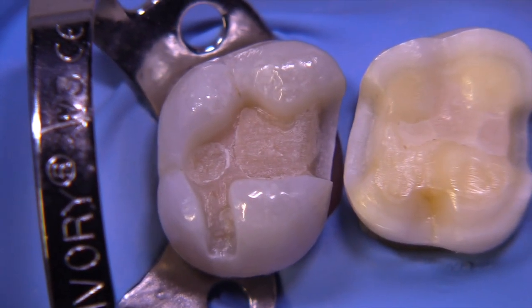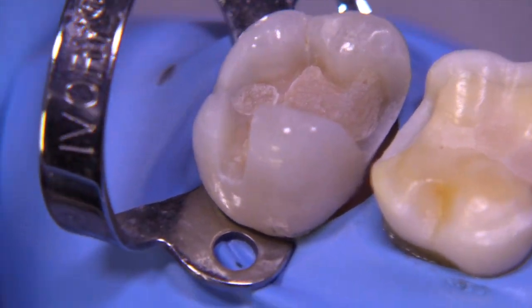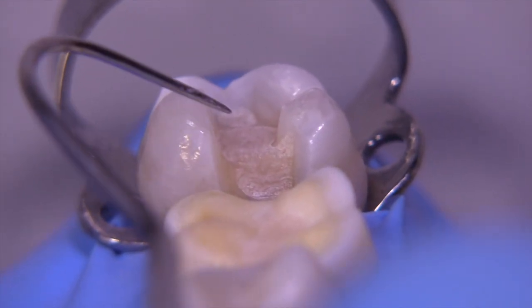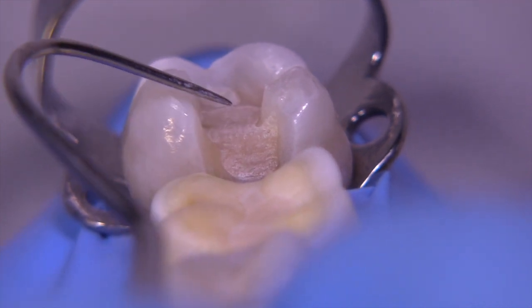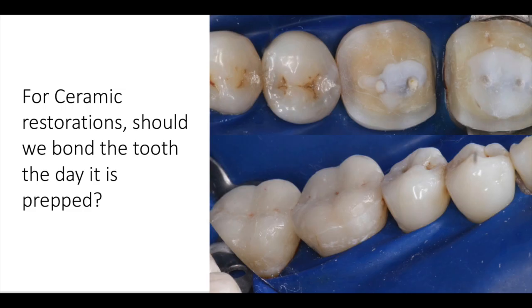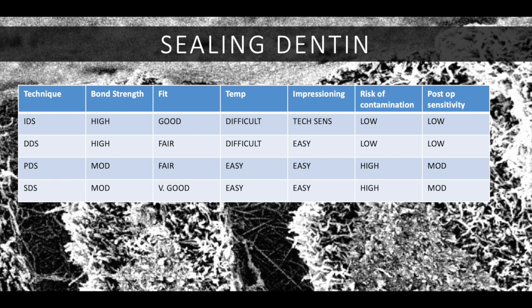The preparation is essentially done. It's key to have good draw and good bulk so the ceramic will be strong at the marginal areas. You should be able to see all the walls quite easily. Take a moment to extrapolate the inclination of the final restoration toward the center and ensure from the tip of the explorer to the pulpal floor you have 1.5 millimeters. Now let's discuss immediate dentin sealing. For ceramic restorations, you have four choices: seal it immediately, delay it after the impression, do it before cementing, or do it simultaneously when you cement the restoration.